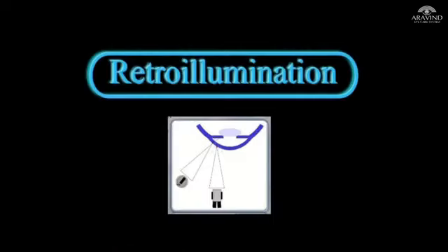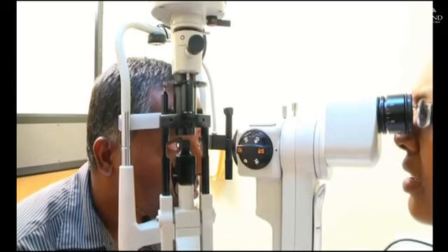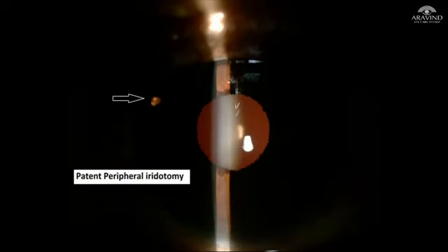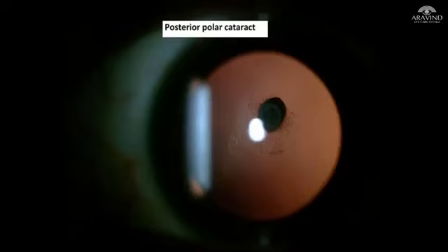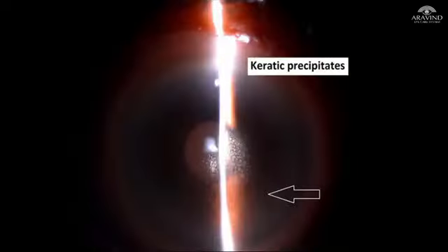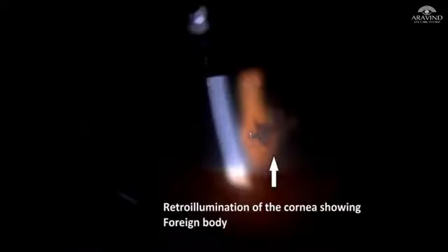Another method of indirect viewing is retroillumination. It is used to look for the patency of peripheral iridotomy, posterior polar cataract, posterior capsular opacification, keratic precipitates, retroillumination of the cornea showing a foreign body.